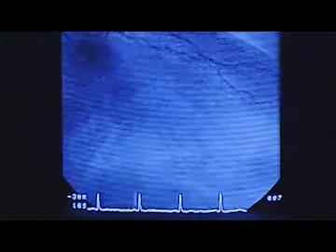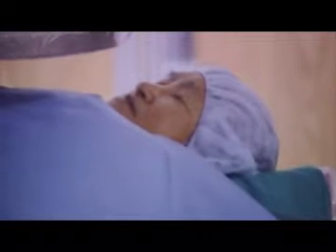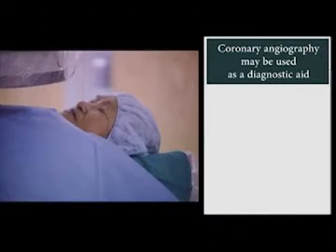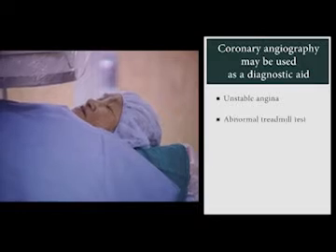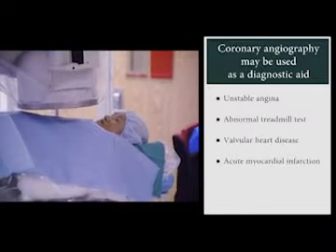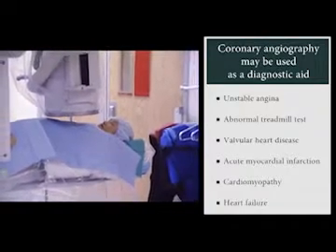to the patient's problem. If a follow-up procedure is decided on, the patient must be prepared to spend additional days in the hospital. Coronary angiography may be used as a diagnostic aid for patients with unstable angina, an abnormal treadmill test, valvular heart disease, acute myocardial infarction, cardiomyopathy, or heart failure.